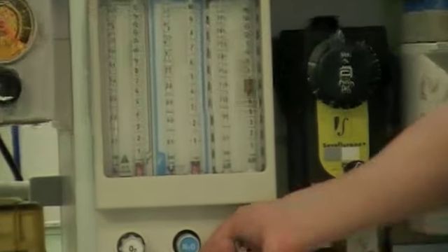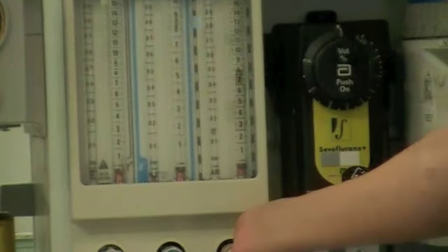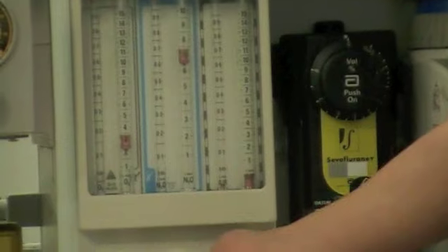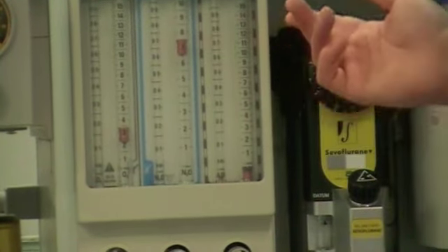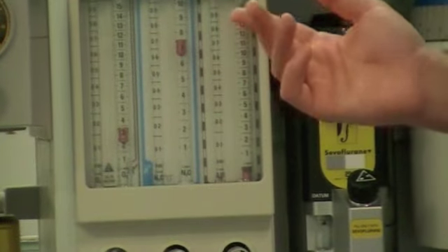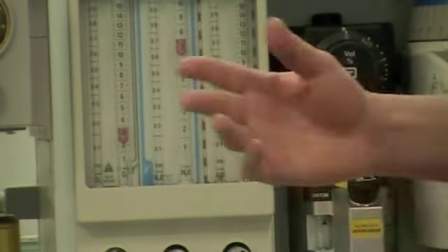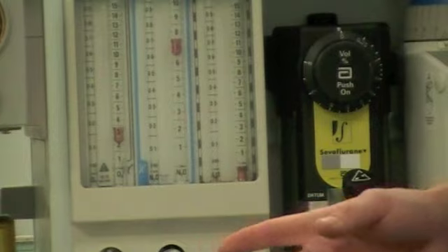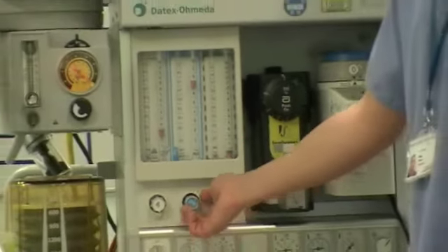You will repeat the same for the air, and then also for nitrous oxide. What you will notice with nitrous oxide is that as the nitrous oxide is being delivered to your patient, the oxygen levels will also start to go up, as indicated by the bobbin rise. This is to prevent a hypoxic mix being delivered to your patient, so it is important to make sure that the oxygen does rise when the nitrous oxide is turned on.